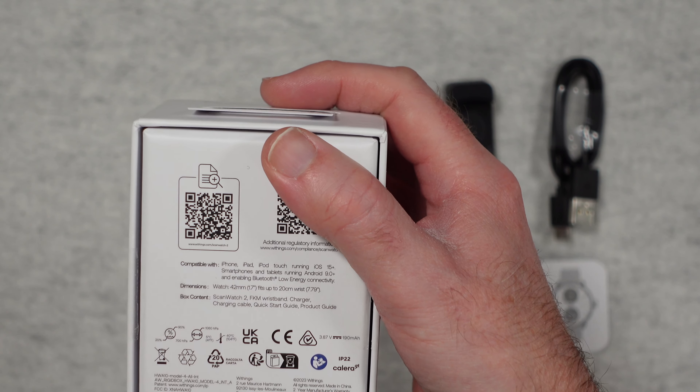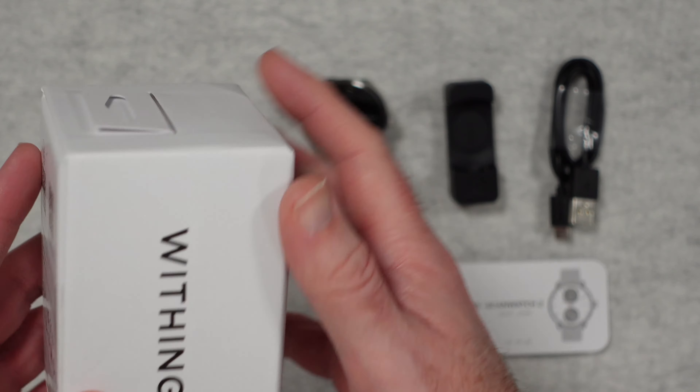This watch looks like a standard analogue watch but it has got so many smart features packed into it. Welcome to my review of the Withings ScanWatch 2.